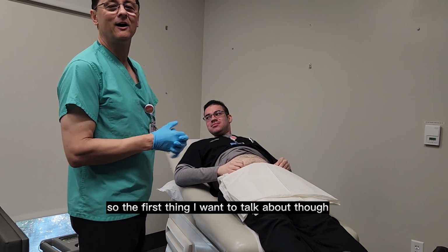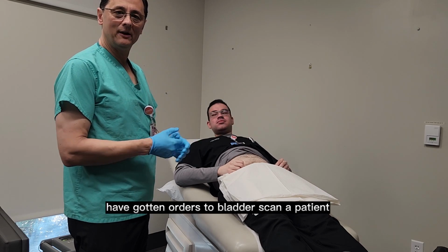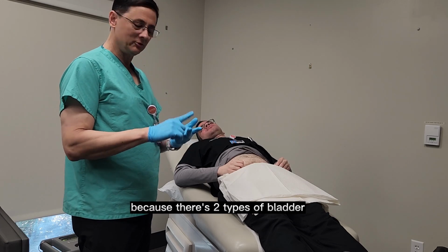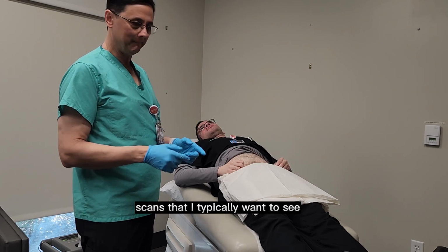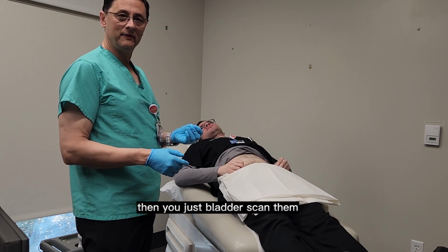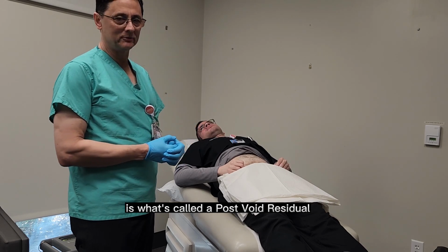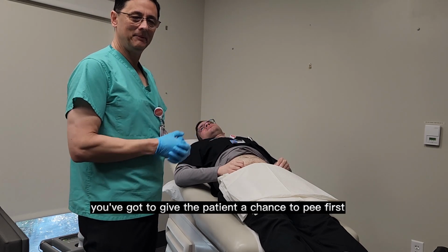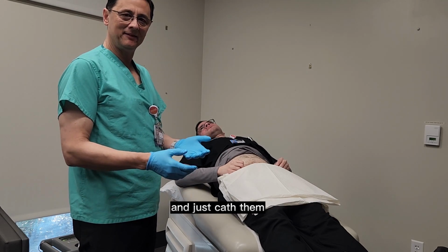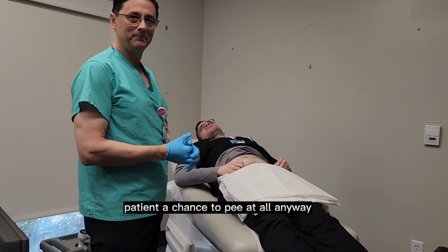So the first thing I want to talk about, though, is bladder scanning. I know a lot of nurses on the floor have gotten orders to bladder scan a patient, but let's go over the terminology first, because there are two types of bladder scans that I typically want to see. It's either a random bladder scan, like if a patient can't urinate at all, then you just bladder scan them. But really what we're looking for most of the time is what's called a post-void residual. In other words, you've got to give the patient a chance to pee first. If you don't give them a chance to pee and just cath them, well, that's not good. That can introduce infections, and you don't really give the patient a chance to pee at all anyway.